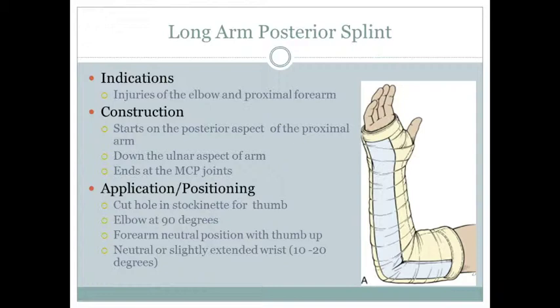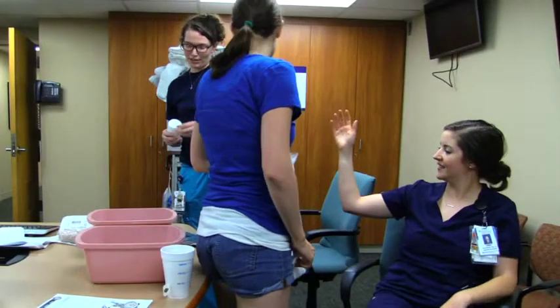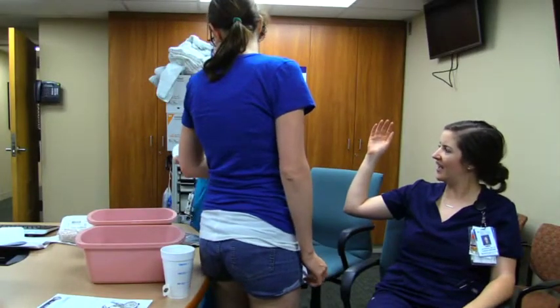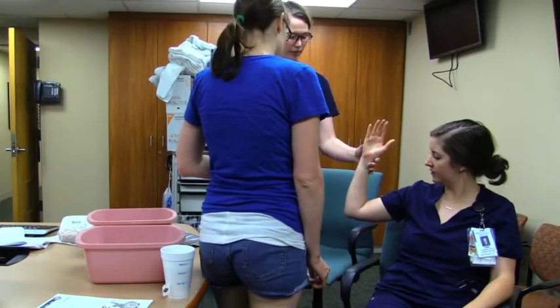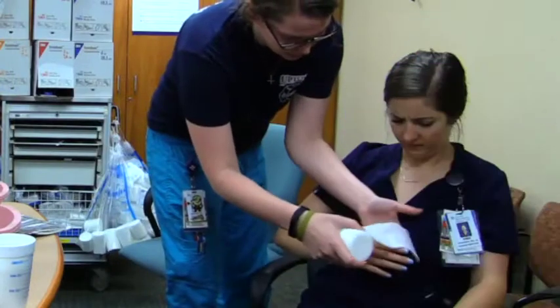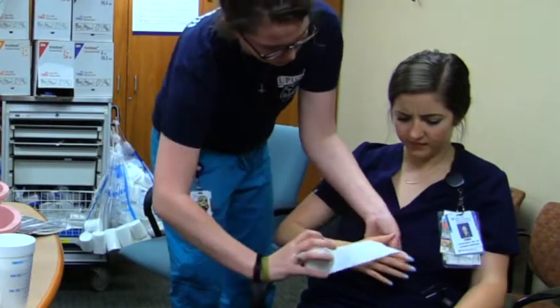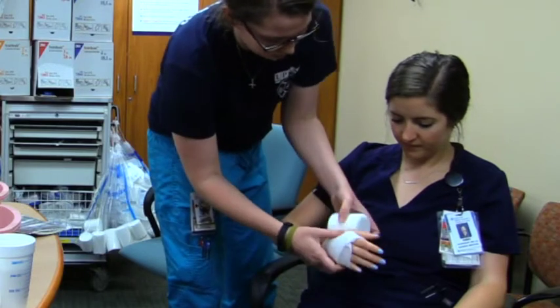First you would put on the stockinette — we don't have one today, but it's essential. You would cut a hole for the thumb to go through and just slide it on. Then you're going to take the webbing and go around and around.